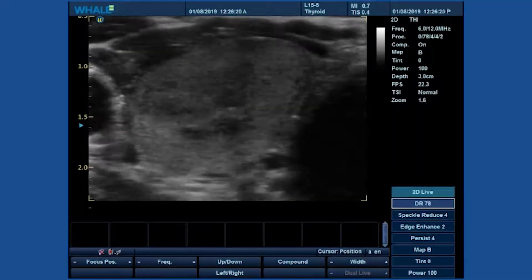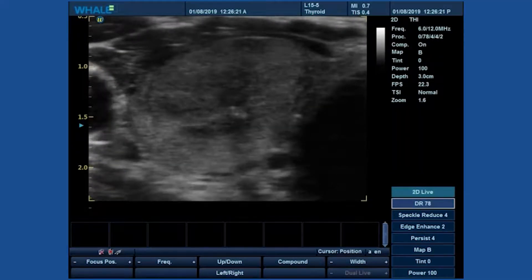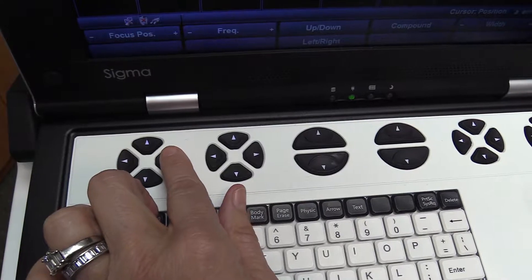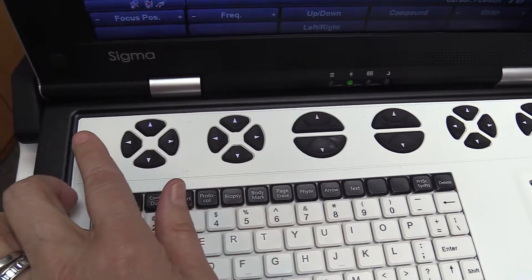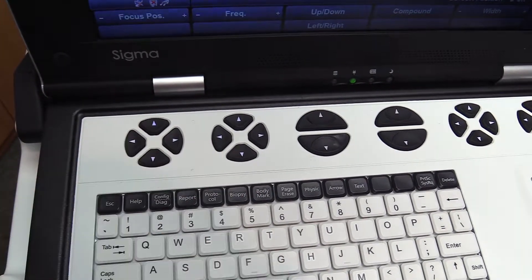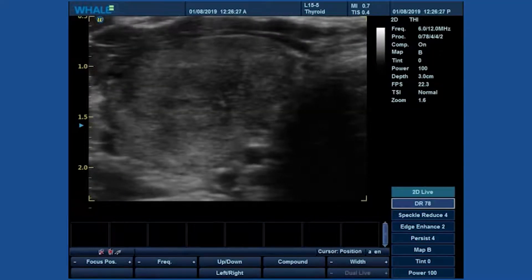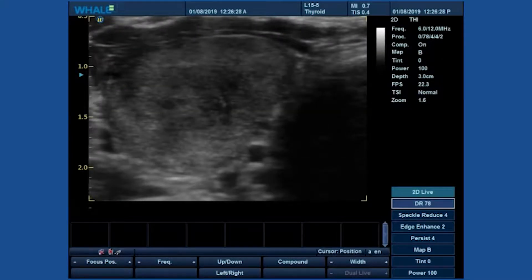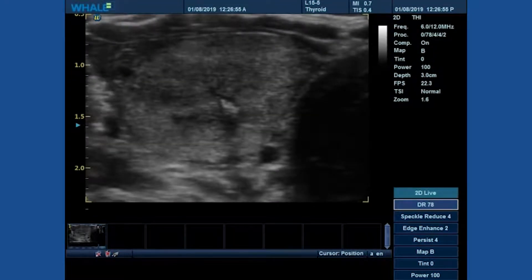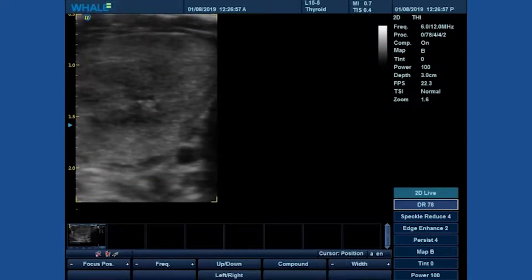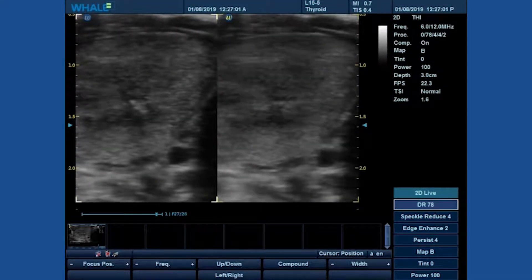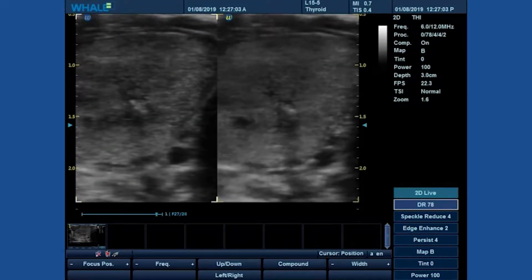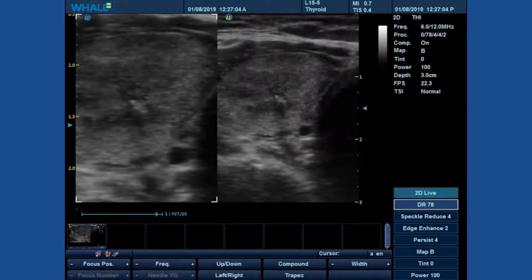You may also still use the focus position to optimize the focal area. For side-by-side comparisons, you can use the split screen with zoom just on one side.